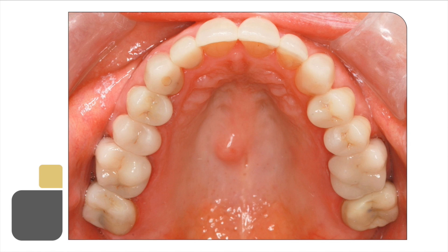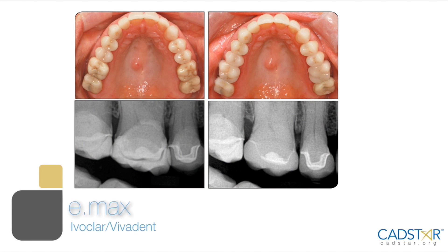The final restorations — we did both the upper right and left first molars and replaced those with Emax. You can see there's a slightly different style of occlusal finishing done by two different assistants; they both look excellent. The important thing is making sure the margins look good. There's the upper right first molar before and after. The final restoration is Emax B1, glass ionomer is our cement, and you can see the margins are so clean. Our spacer can be controlled extremely well.